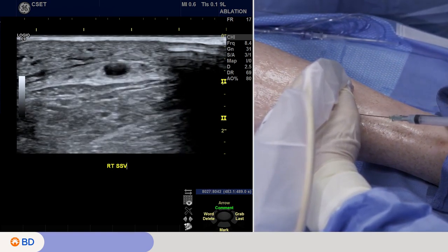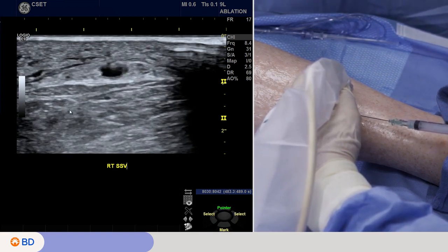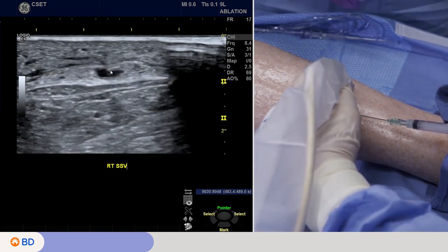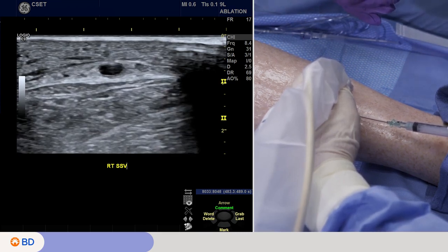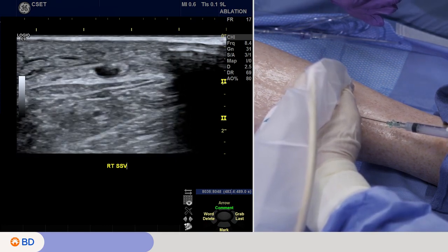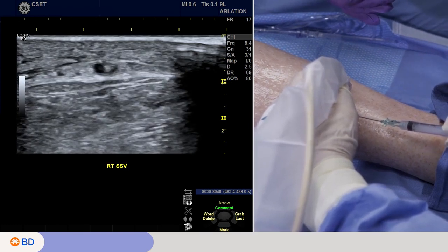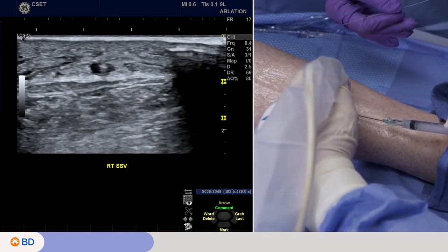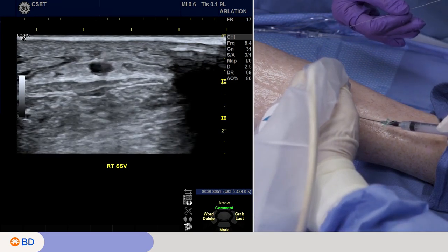I'm going to stab through the skin. As you see on the ultrasound, I'm poking through on the front wall of the small saphenous. I'm intentionally showing you where I like to have the needle, right in the middle of the circle, the globe. If you're off to the side, it can bounce off, but you can see I'm really well positioned here. Then I make a quick little stab like that as I aspirate, to see if I am through. I don't have return, so I think I'm catching the front wall a little bit, and now I did.